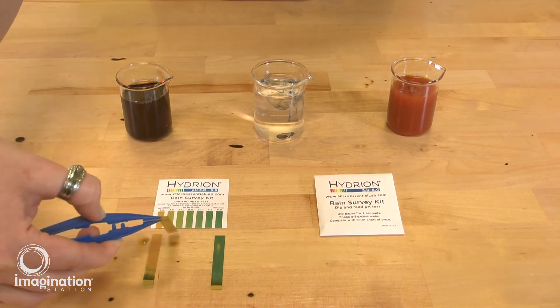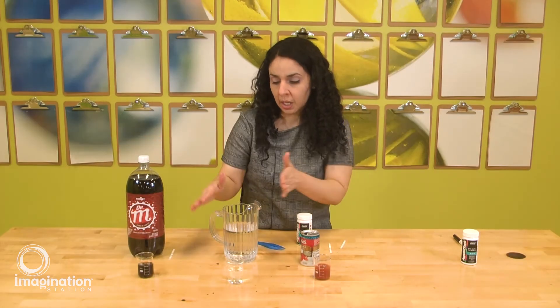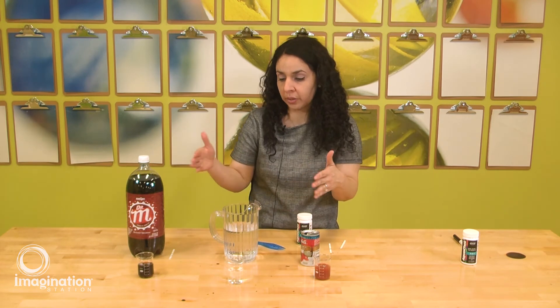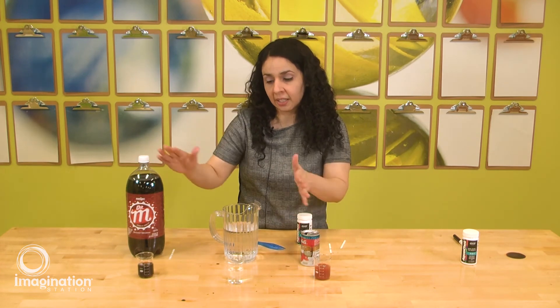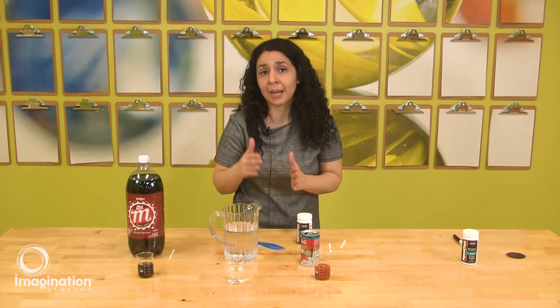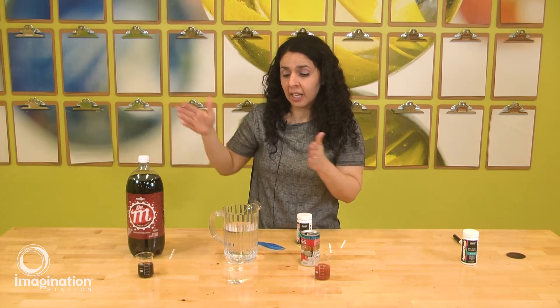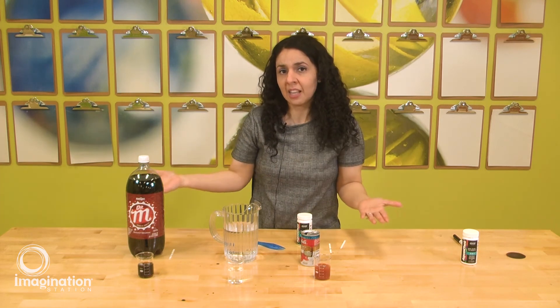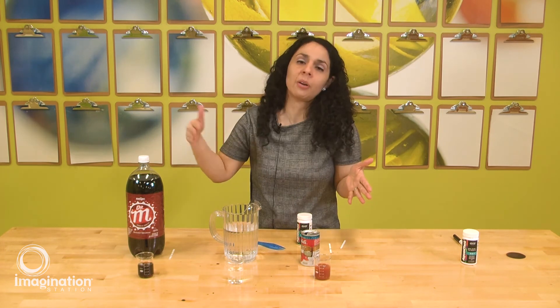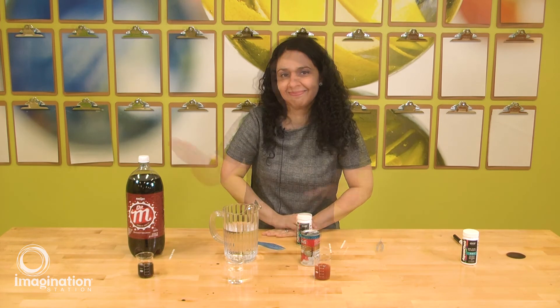So now we can see that we have different pH values for the different solutions: pH 3 for Coke, pH 7 for water, and pH 4 for tomato juice. We now know that Coke and tomato juice are more acidic and the water is more neutral. Solutions you find at home might be in the alkaline range — above pH 7 — and this way you can test many different solutions and understand how each one has a different pH range.